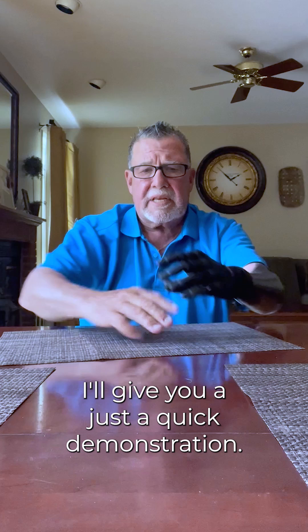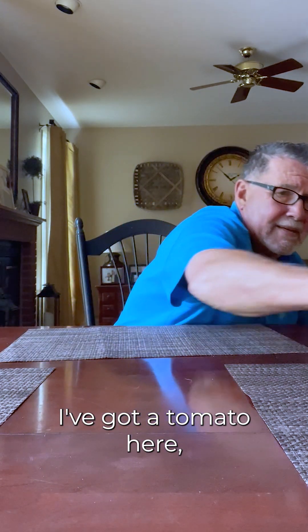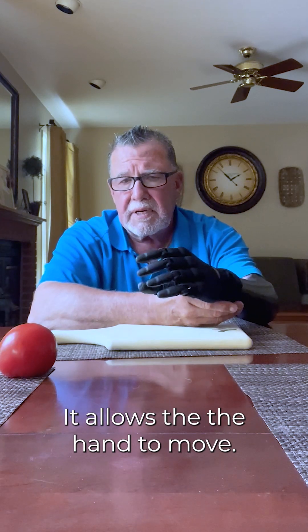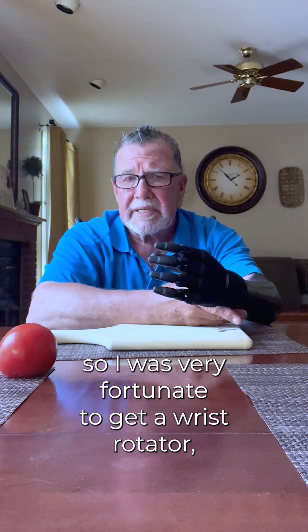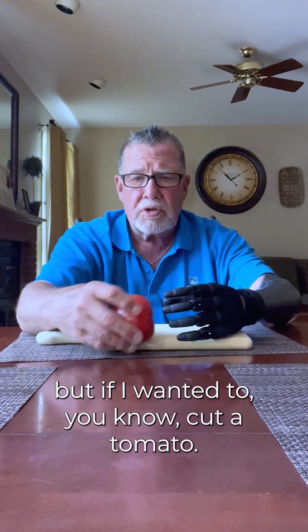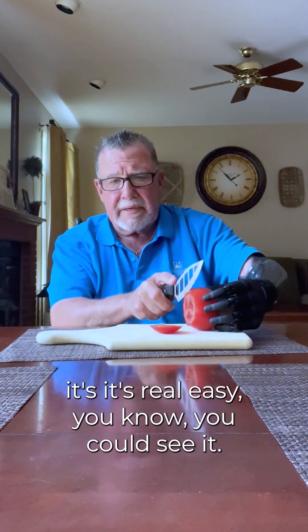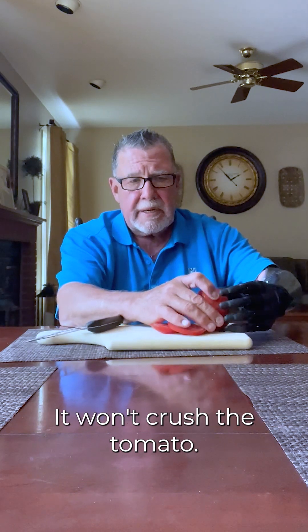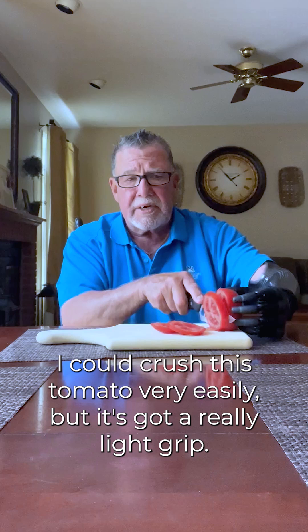I'll give you just a quick demonstration. I've got a tomato here, and I also have a wrist rotator in this, which is kind of nice — it allows the hand to move. So if I wanted to cut a tomato, it's real easy. You can see it holds it nice. I can open it, I can move it back a little bit. It won't crush the tomato. I know I could crush this tomato very easily, but it's got a really light grip.